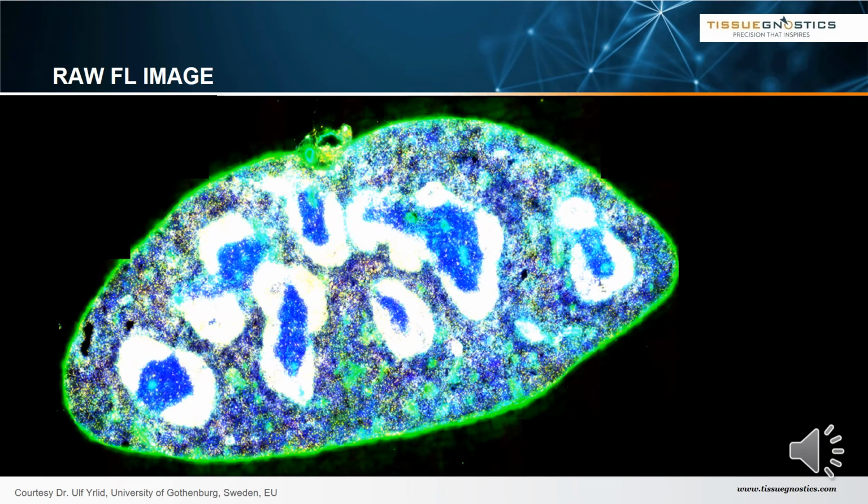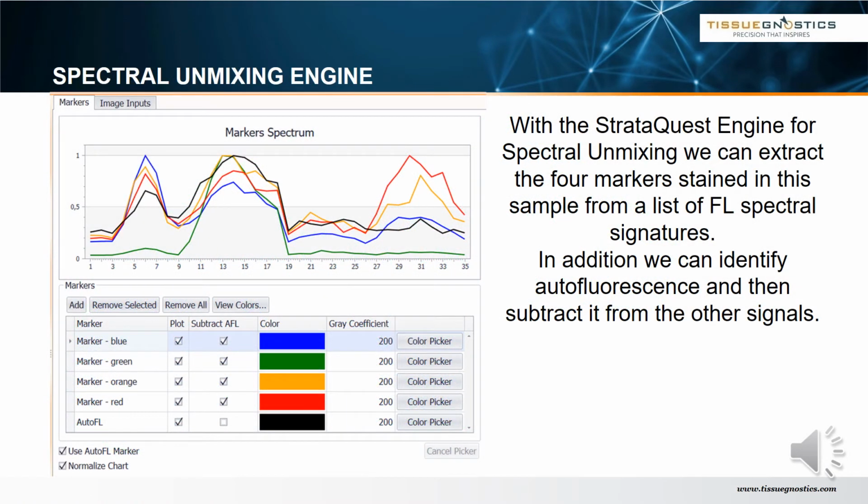What we get in first place when we visualize a LAMBDA-STACK looks like this. Obviously it's not nice. The image shows severe oversaturation, spectral overlap of neighboring fluorochromes. But now comes the magic. In fact, it's not magic, it's mathematic.